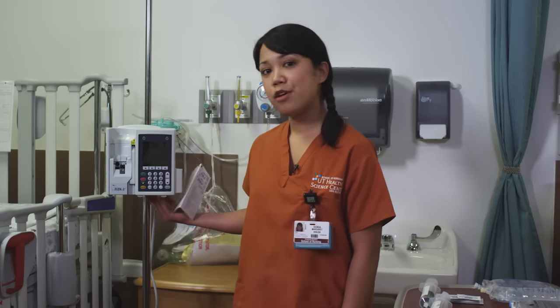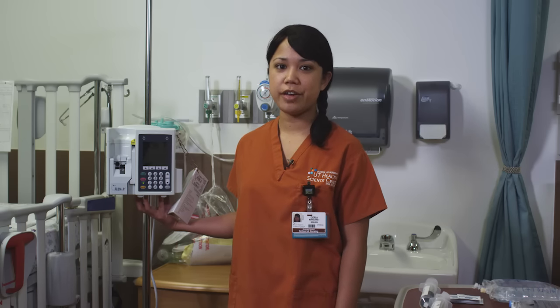Hi, I'm Margaret Doria and I'm a student here at the UT Health Science Center. We are here at the pediatric room of the Center for Simulation Innovation. The purpose of this video is to introduce you to the Plum IV Pump, which is used at the Methodist Hospital. This will help you with your clinical experiences at the hospital and also with simulation here in the lab.